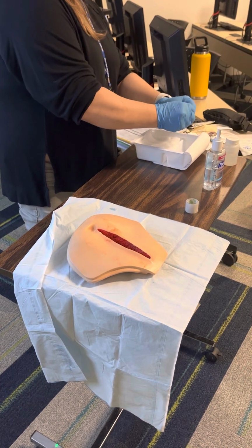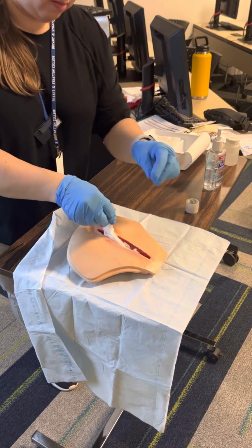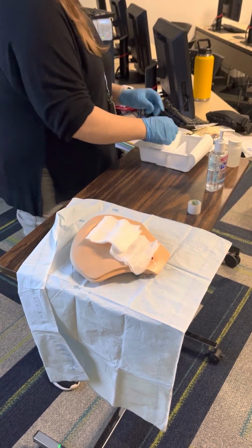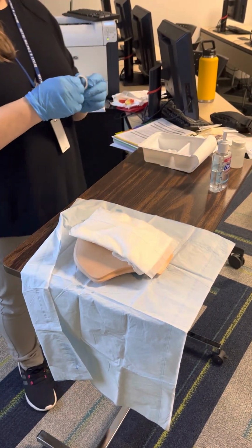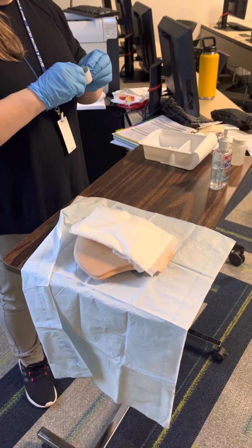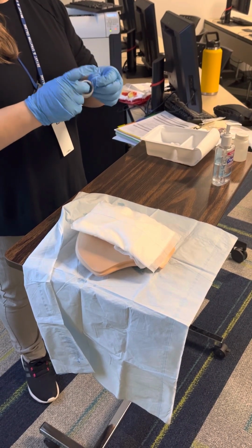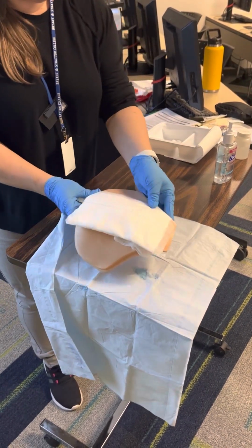I'm going to place it in the wound and not on the outside skin. I'm gonna take a gauze on top, a gauze on the bottom, abdominal pad. Find the edge of the tape maybe. I'm gonna tape all 4 sides.